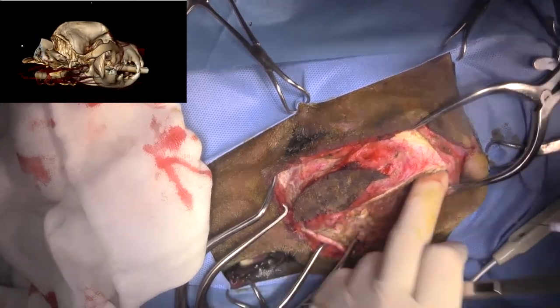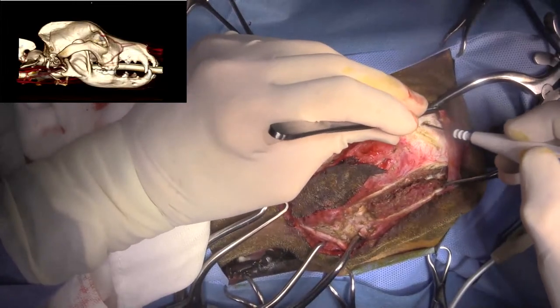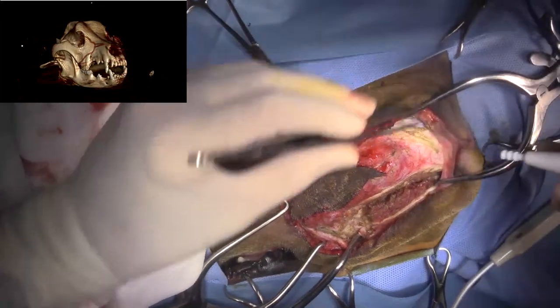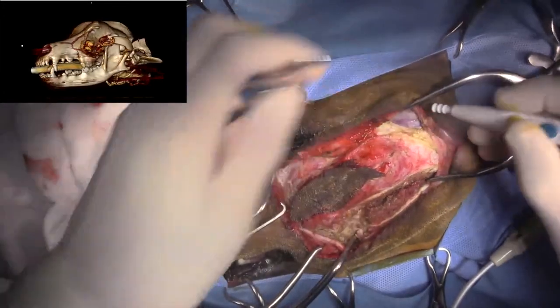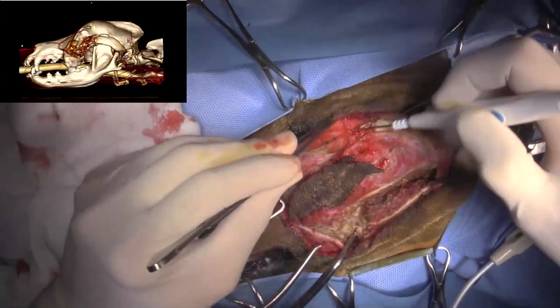And early on in these surgeries, I like to be really slow and meticulous, trying to preserve blood supply and being aware of my anatomy and stuff. I know that things can get crazy a little bit later, and then we have to operate in a more hurried fashion. But while I can, I like to take it really slowly.